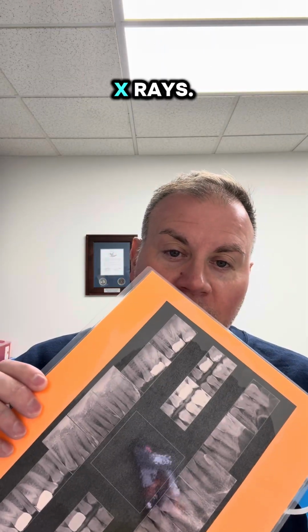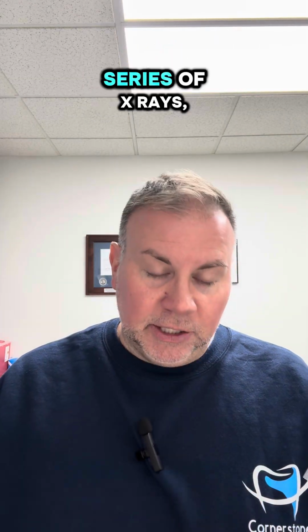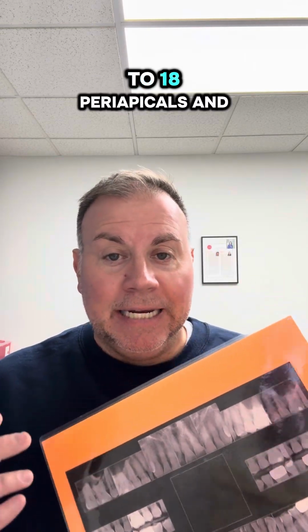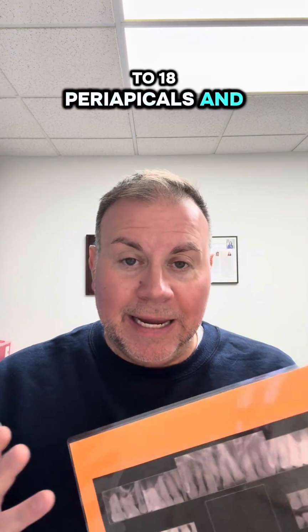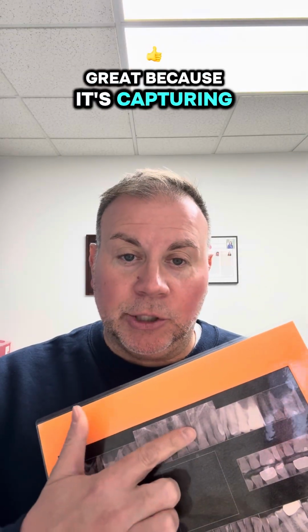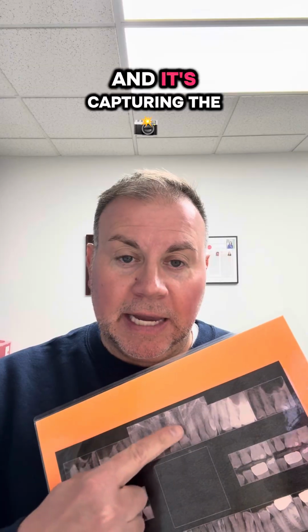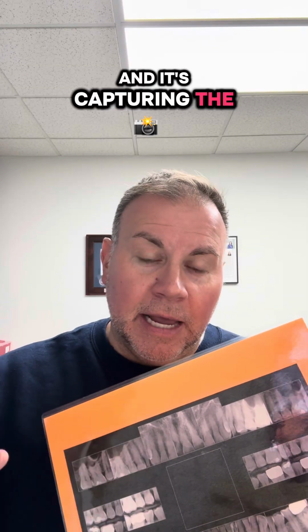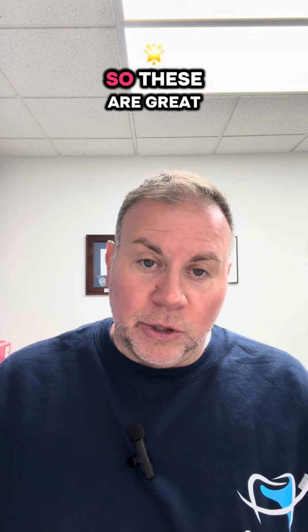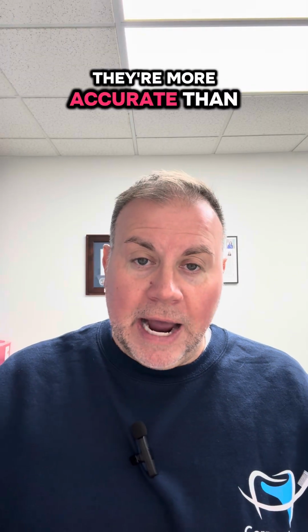Now, the full mouth series of X-rays. This is typically 14 to 18 periapicals and bite wings taken together. These are great because they're capturing single shots and capturing the apex of the tooth. We're seeing the complete teeth on these. So these are great for diagnosing. They're more accurate than a Panorex.